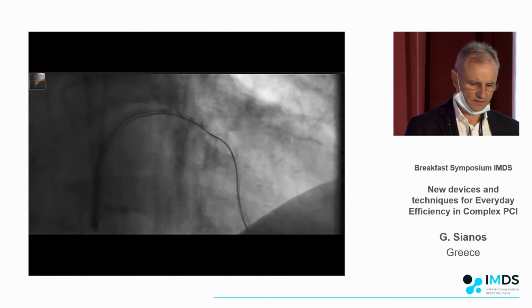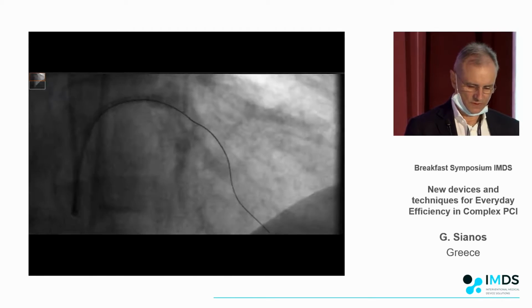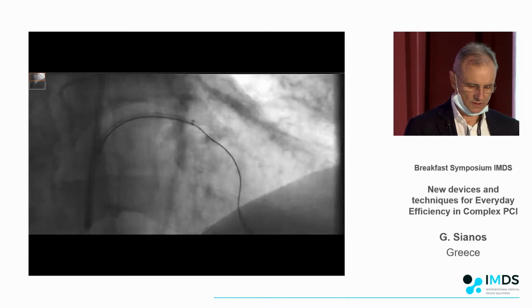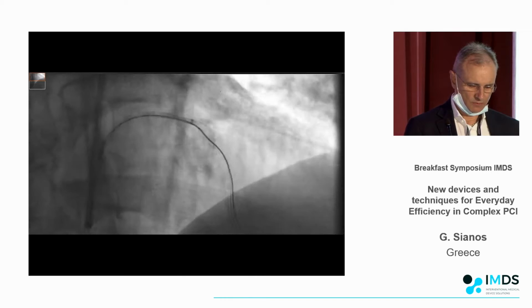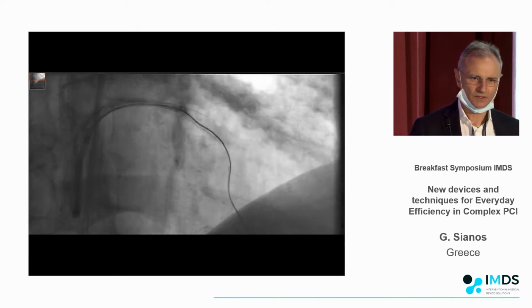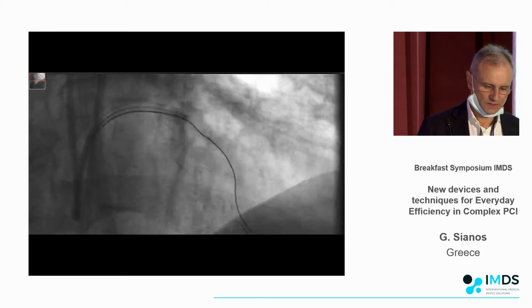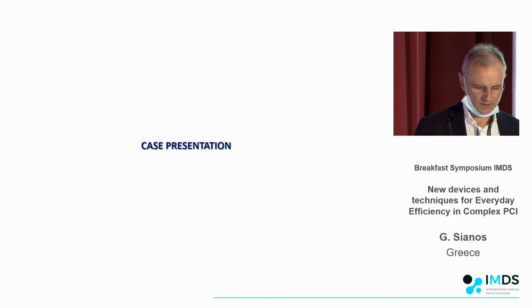And look at that. He has the Blimp there, and he's pushing in a way, if you focus on that, and you will see it even better here. He pushed so much that essentially the balloon is back there. The entire tip of the balloon has circled into the vessel, and then he knuckled the balloon, let's put it in this way. It shows that you have to be familiar with the technology in order to be able to apply it carefully.